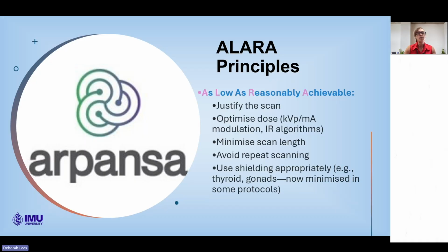The ALARA principles stand for as low as reasonably achievable. And this is by the Australian Radiation Protection and Nuclear Safety Agency. So you will have something similar in Malaysia, which will be a Radiation Safety Council, and they will have specific legislation about what is acceptable to expose a person to and what the radiation standards are for the institutions. So the ALARA principles are, we have to justify the scan. So you can't just sign someone up because you just feel like it. You have to have a reason.